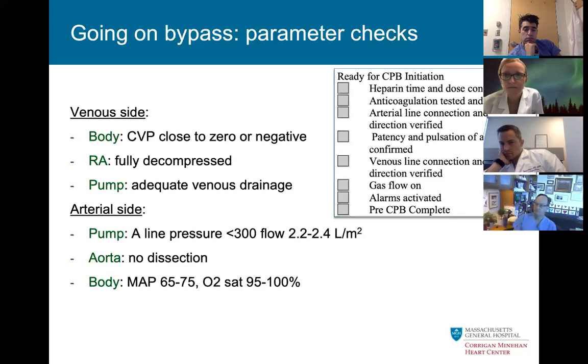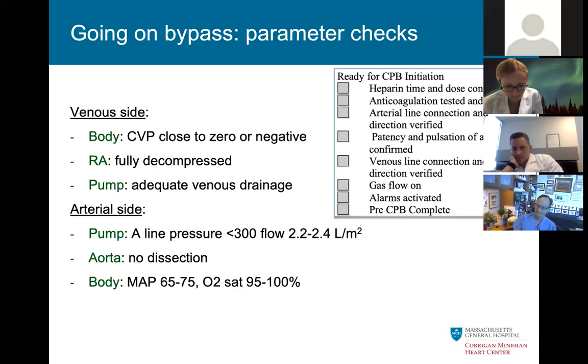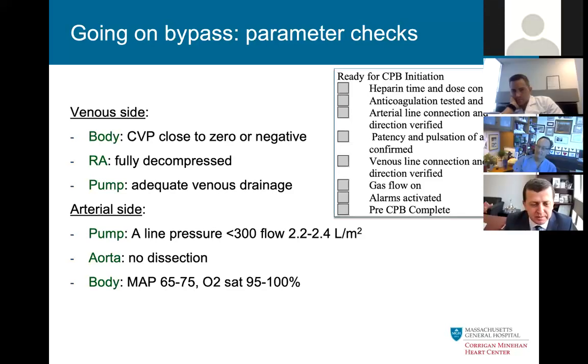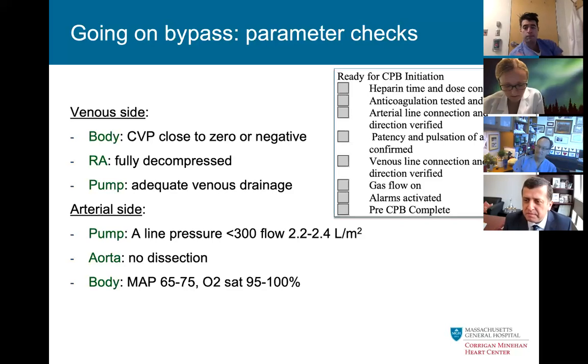So Antonia, why would you think, if you don't give heparin, I mean, if you do ECMO, you don't give heparin, probably the patient will live. And in this case, the patient, as Dr. Sanz said, will die. Why is that? Can you explain that to me? Well, if you don't give heparin, you can form thrombi throughout the entire circuit. But why does that not happen on ECMO? What's the difference?